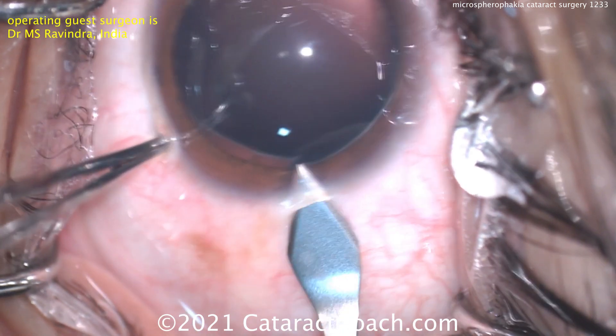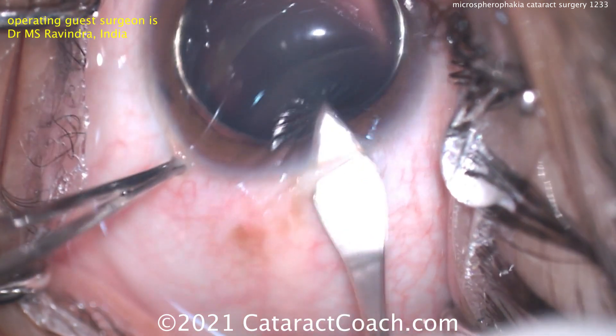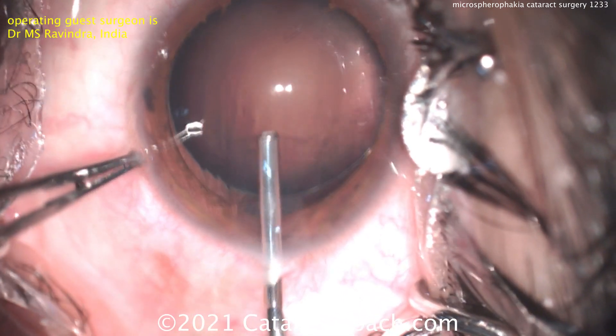This is a tough case because this lens is very odd in its dimensions, plus the zonular support is very weak. So we'll make that incision here and put some viscoelastic inside the eye.